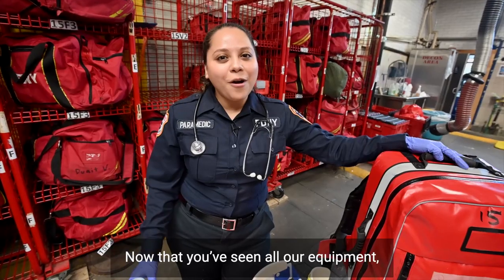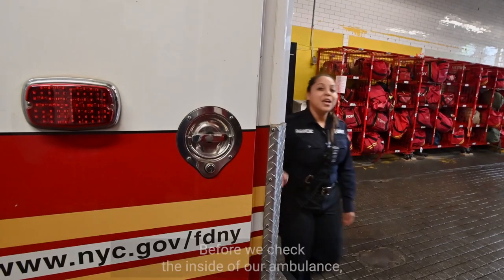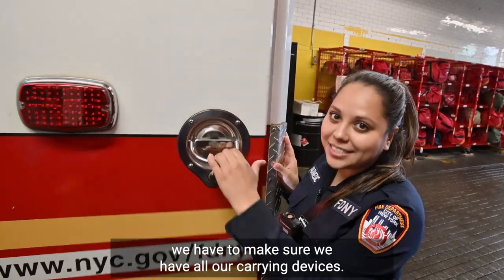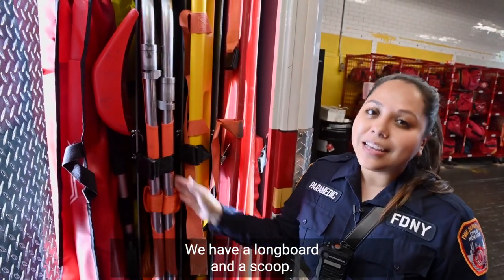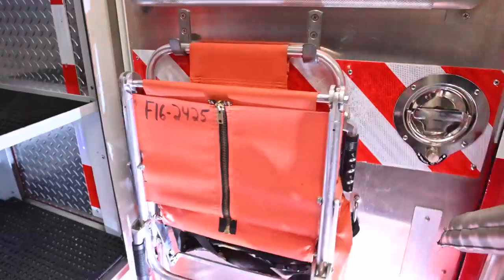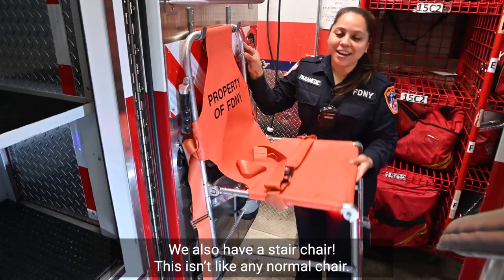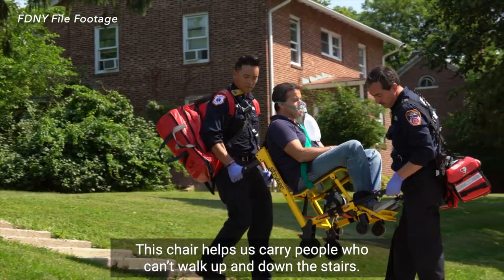Now that you've seen all our equipment, it's time to pack it up and be ready for the next emergency. Before we check the inside of our ambulance, we have to make sure we have all our carrying devices. We have a longboard and a scoop — these devices are used to carry people who can't walk on their own. We also have a stair chair. This isn't like any normal chair; it helps us carry people who can't walk up and down the stairs.